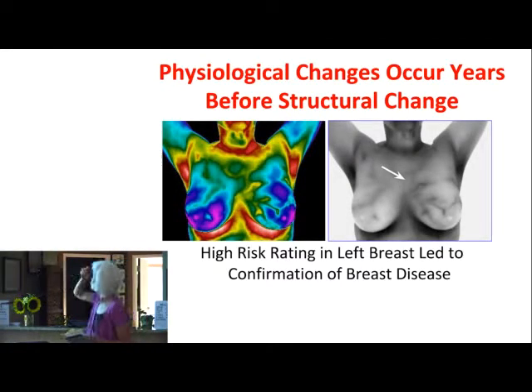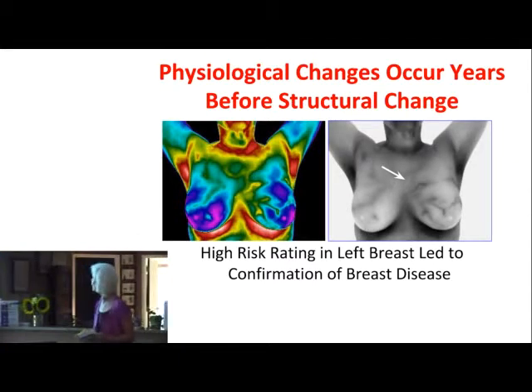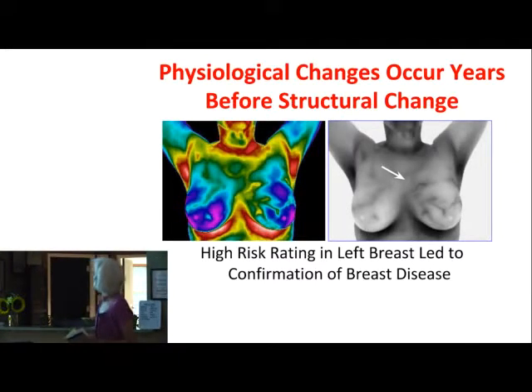This before and after shows a lady who had a normal mammogram, but had a high-risk thermogram. You can see why she had the high-risk thermogram. Do you see that area of yellow in her left breast? After the high-risk thermogram, she most likely went on to have an ultrasound and MRI, and she was confirmed with breast cancer. People always say, can you see breast cancer in these images? No, I can't. I can tell you've got heat. I can tell you something's going on in that area of your breast.